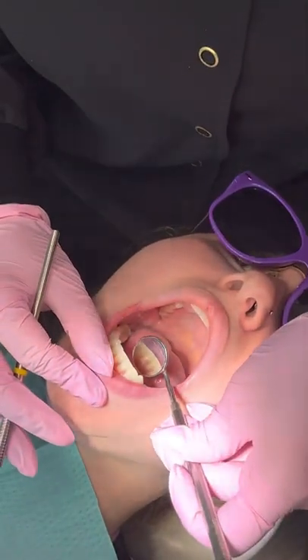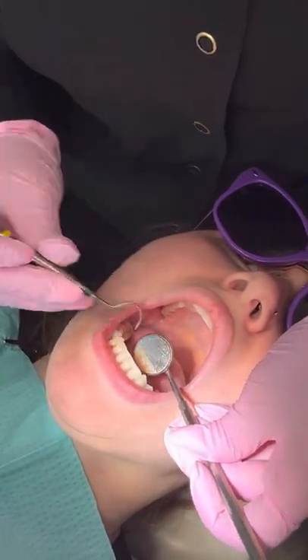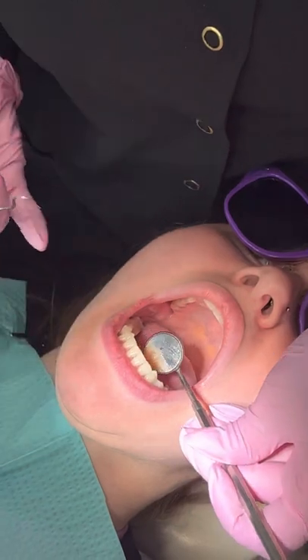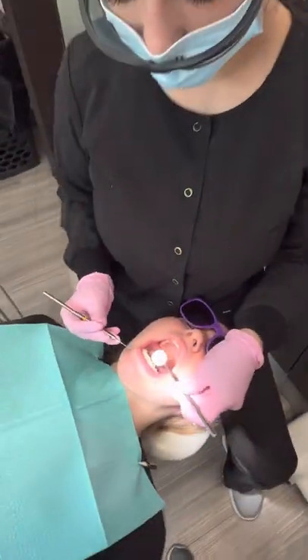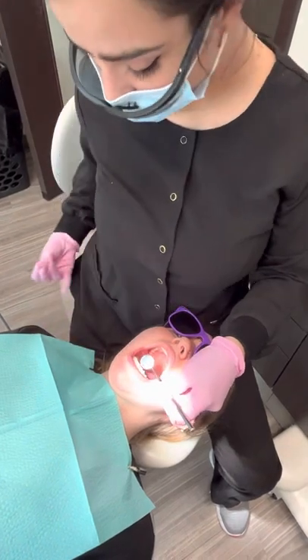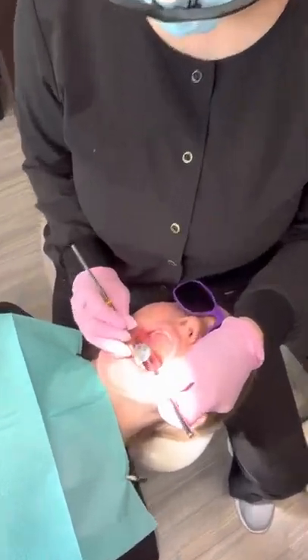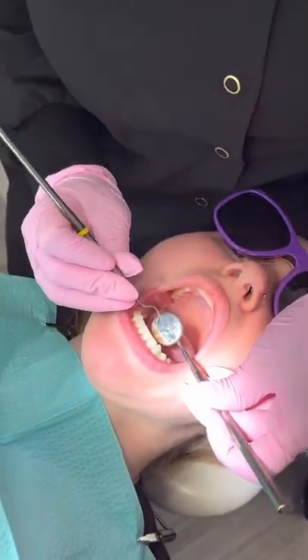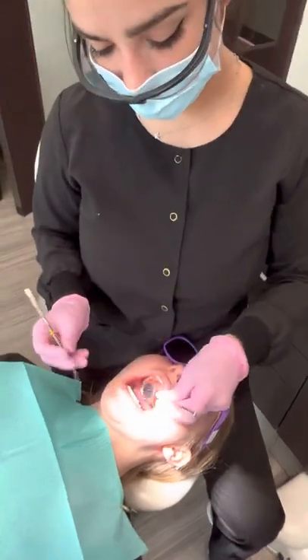Next I'm going to check down on the bottom to see if there's any calculus, again using indirect vision. You'll notice that even as I'm using my mirror and explorer, my body posture is still the same — those elbows are in, I'm sitting at a straight back angle with feet planted firmly on the ground. Use your mirror; don't bend your body. You want to be using your mirror the entire time.